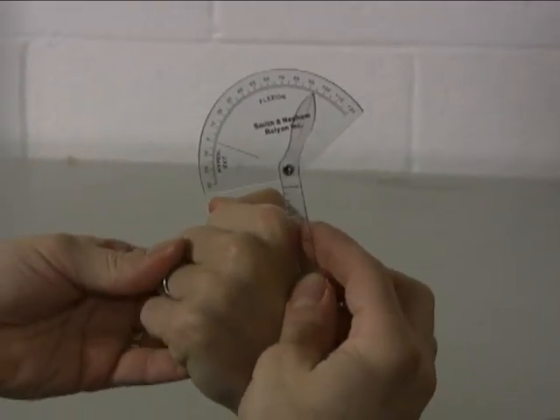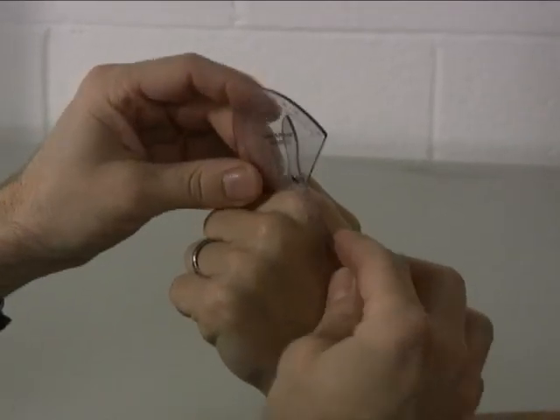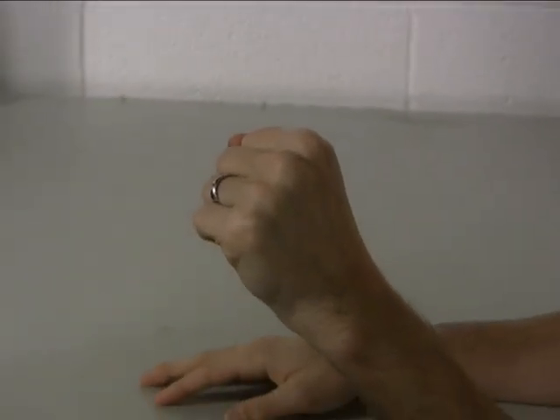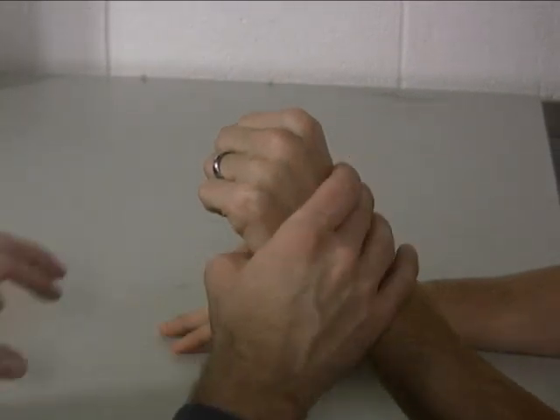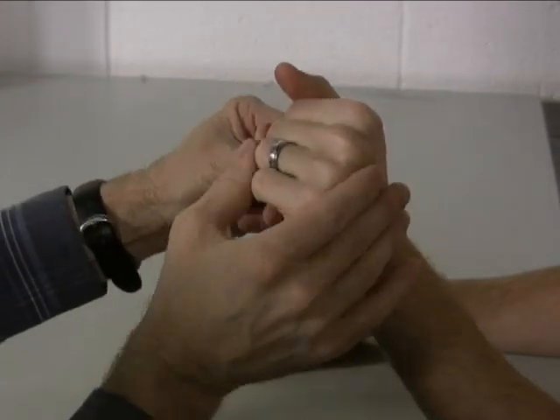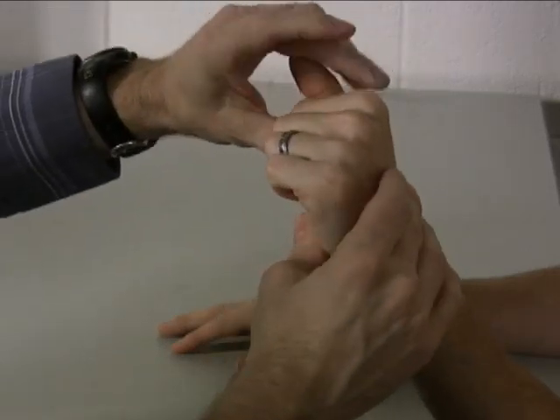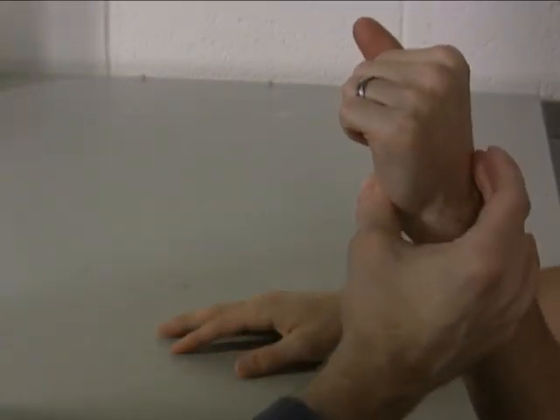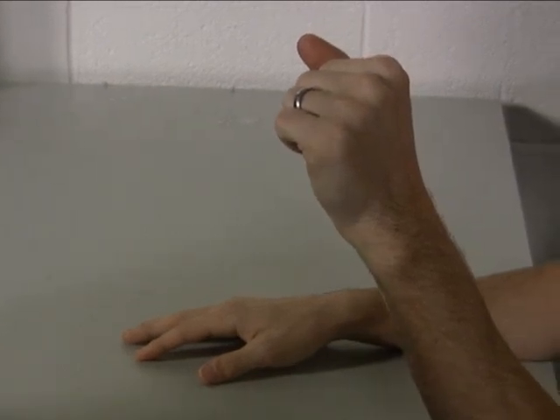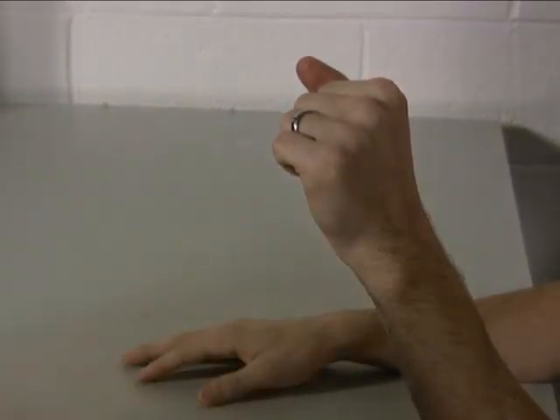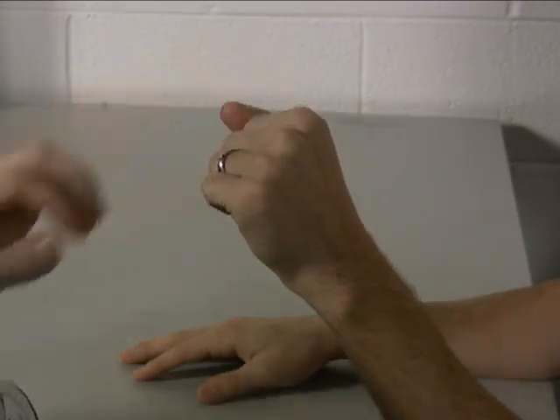We use the full fist when we're doing the flexion measurement because that's how the American Medical Association norms are done. The American Society of Hand Therapists actually prefers that you use a flat fist with the tip joints or the DIP joints of the fingers straight rather than a full fist to avoid any passive insufficiency issues with this measurement.